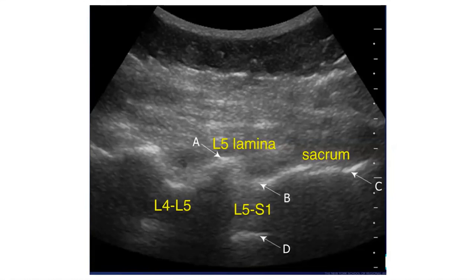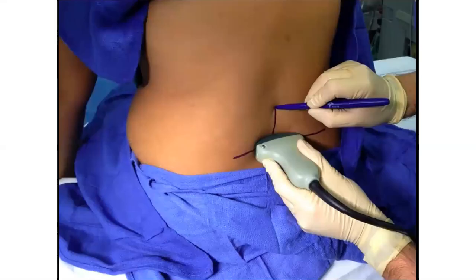And then you'll see that this is followed by the L4-5 interspace. Okay, so the lamina are the peaked grooves. This is sometimes also referred to as the camel hump appearance. And on the patient's skin, you'll then be making markings as to where you find the interspace, so the interspinous space, as well as the midline.